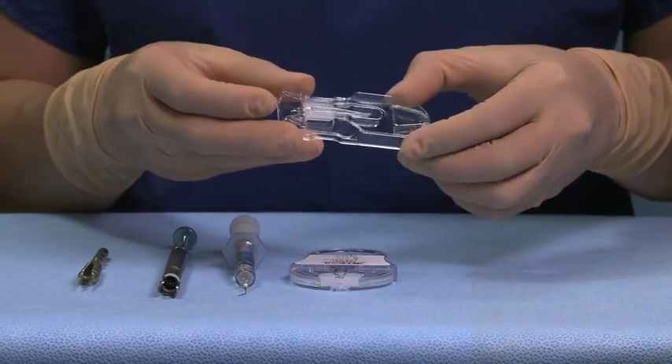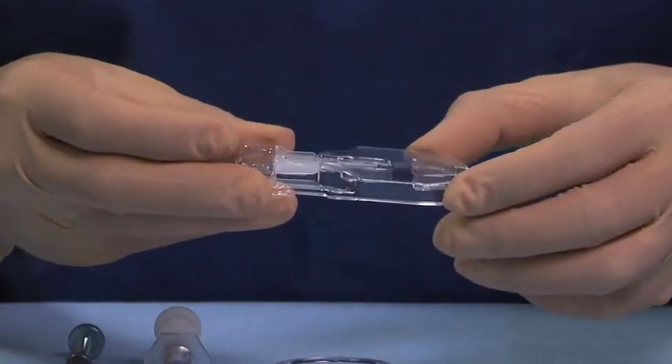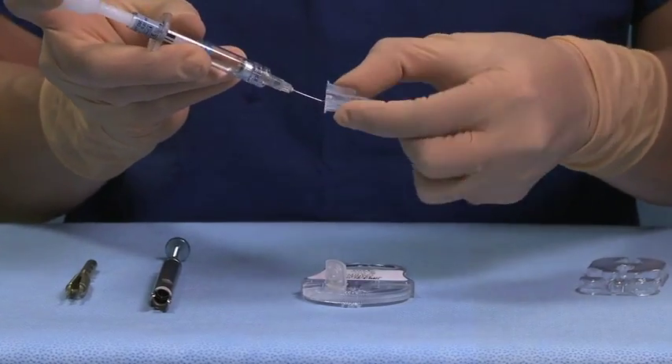To load the Unfolder Platinum 1 Series cartridge, first remove the cartridge from the inner tray and fill with Helon Viscoelastic.